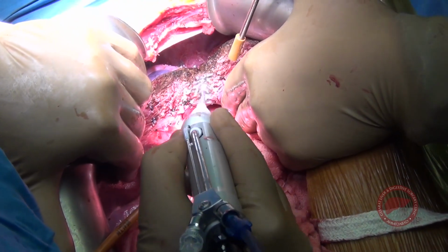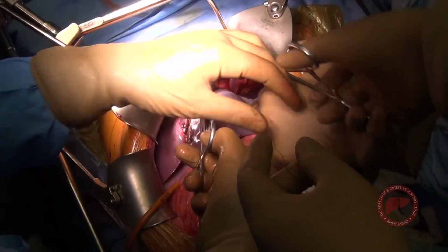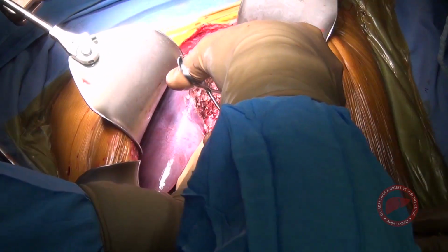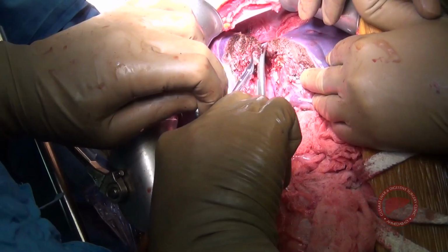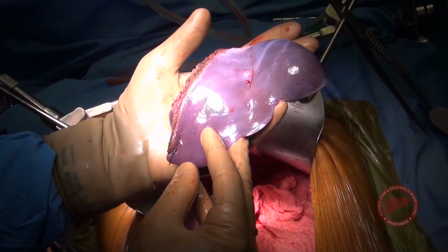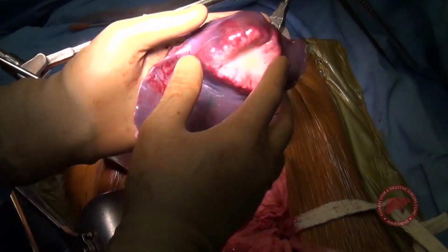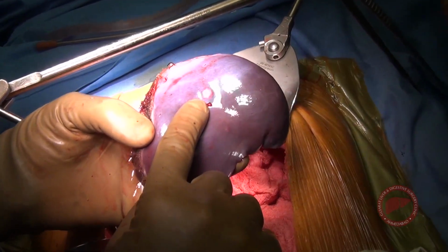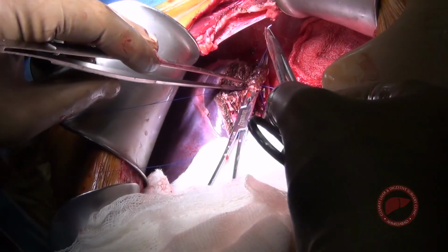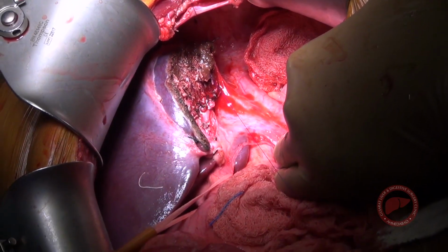So parenchymal transection progresses further and you can see we are approaching the left hepatic vein there. A spoon clamp was applied and the left hepatic vein was divided. So that is segment 2 and 3 with one large and one small liver metastasis. Left hepatic vein orifice was closed with the help of Prolene in 2 layers.